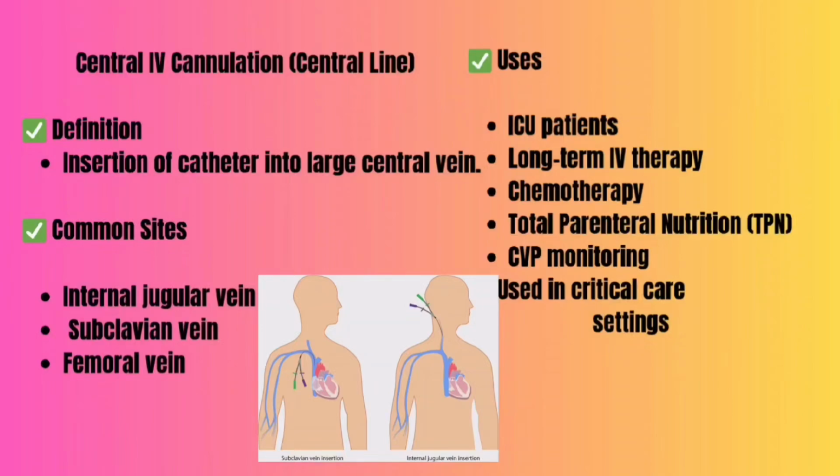This central IV cannulation we use for long-term therapy, long-term IV fluids or medications, for patients who are unconscious, intubated, and most emergency and critical patients.